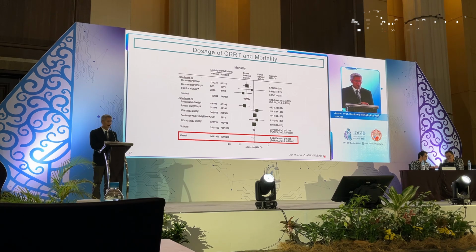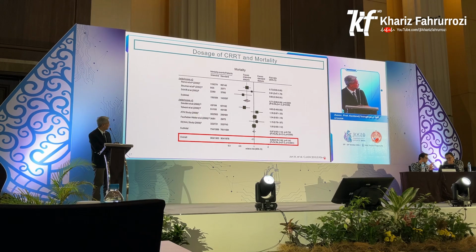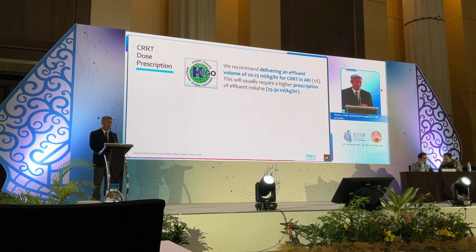And what about the appropriate dosage for CRRT? You can see that in the beginning of the 2000s, it seemed to favor a higher dose of CRRT. However, after that, around 2008 and 2009, the evidence showed there was no difference in outcome between a higher dose and a standard dose of CRRT. Right now, the clinical recommendation is to perform CRRT with a dosage of 20 to 25 ml per kilo per hour.